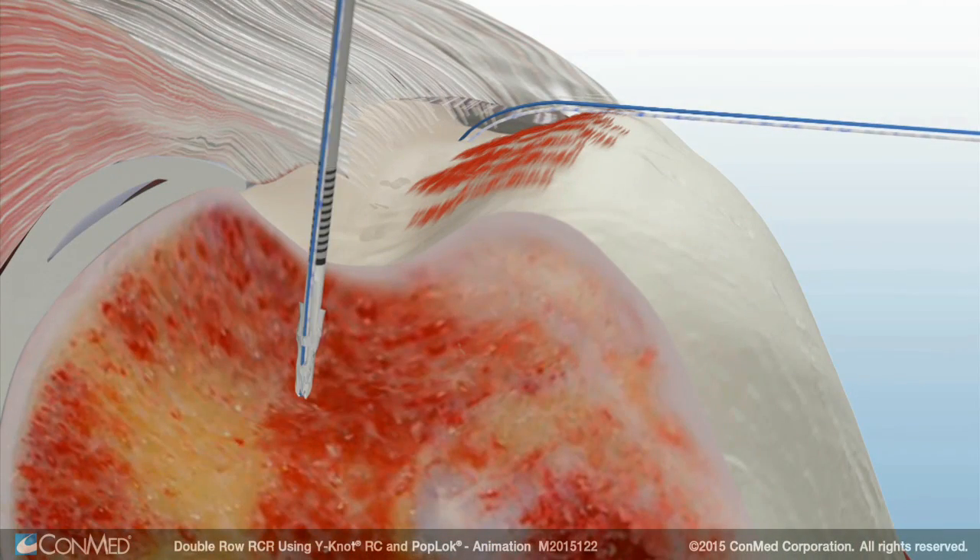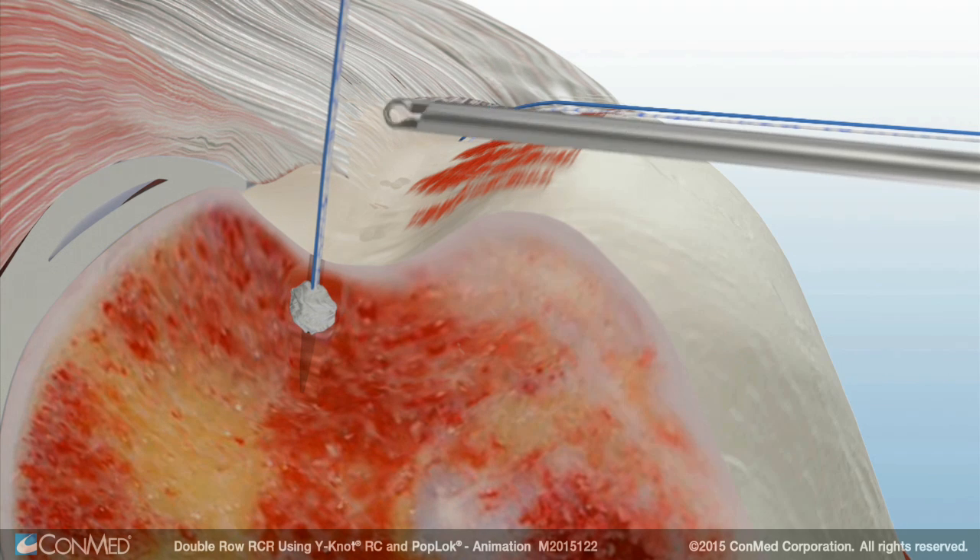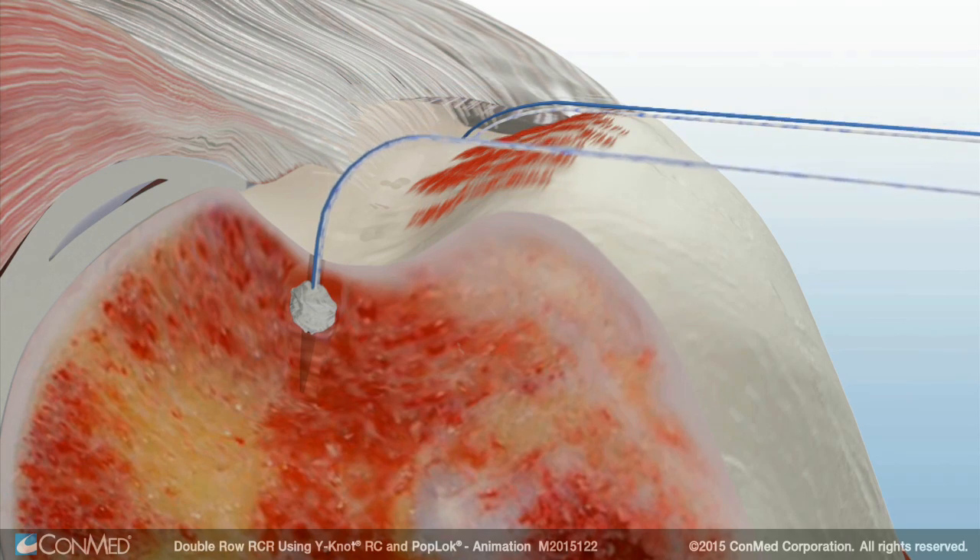A second anchor is then inserted. The Y-Knot RC anchor contracts vertically and expands laterally to provide 360-degree form-fit fixation.